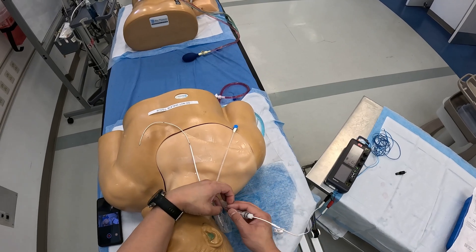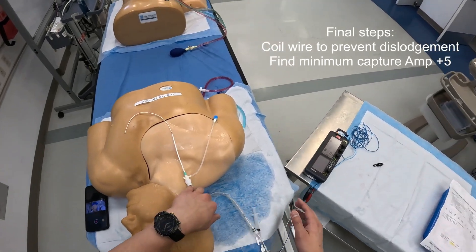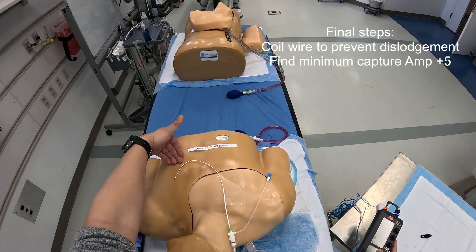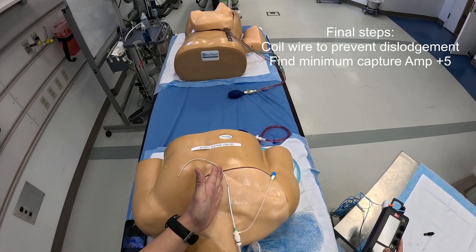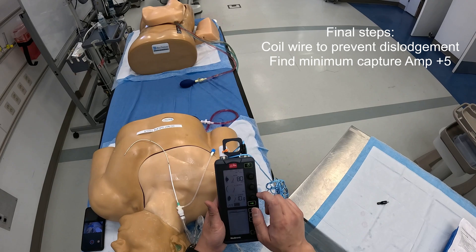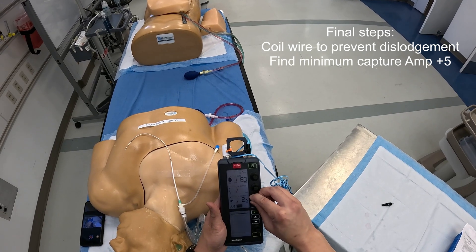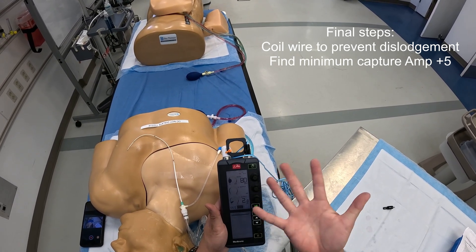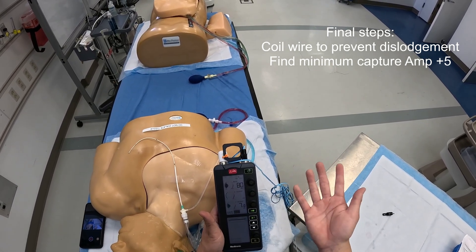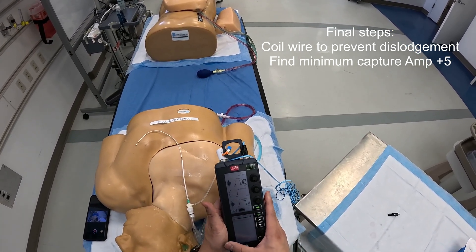Once you've sterilely applied this, make a little circle, tape it to the patient, and hang the box on the gurney. During this entire procedure, your non-sterile person should be using ultrasound to visualize the heart in the apical four-chamber view as the catheter goes into the right ventricle. The last job is to check the box: decrease the current below 10 mA until you lose capture. Once you lose capture — let's say at 2 mA — increase it back up by plus 5. In this case that would be 7 mA. Lock it, leave it at that, hang the box, and let cardiology do their thing. Thanks everyone.